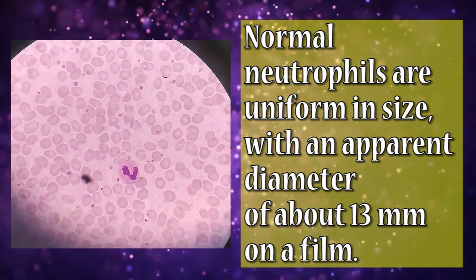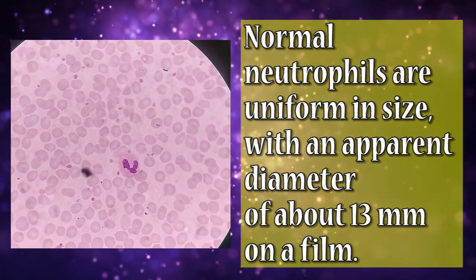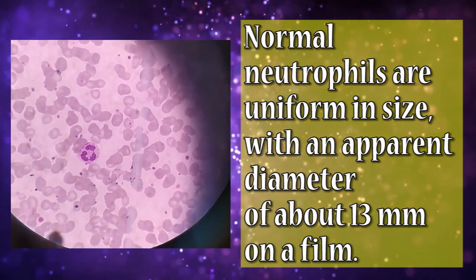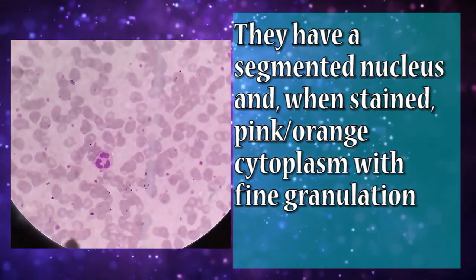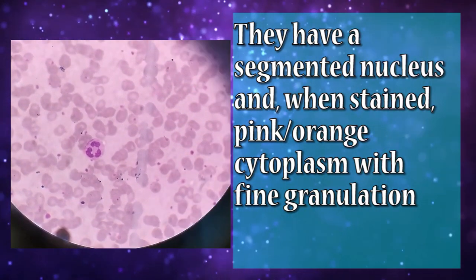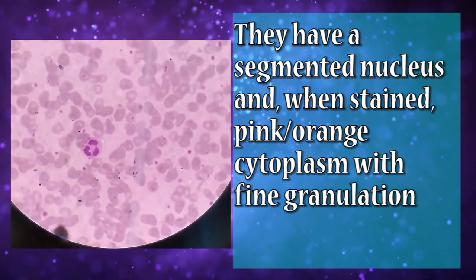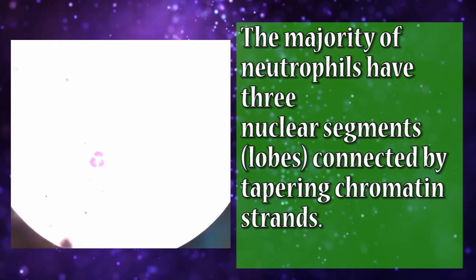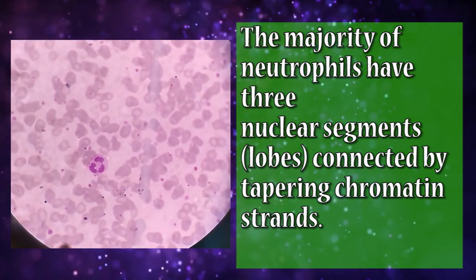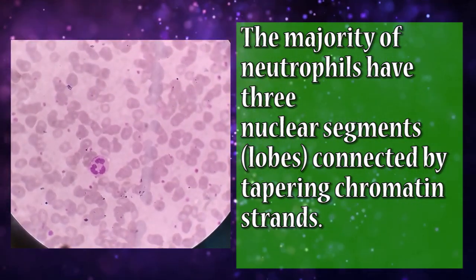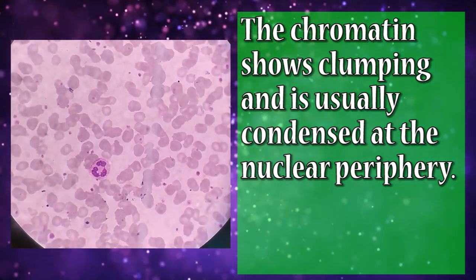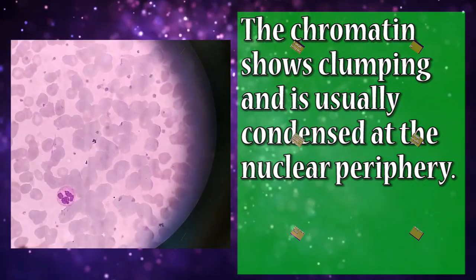Neutrophils are uniform in size with an apparent diameter of about 13 micrometres on a peripheral blood smear. They have a segmented nucleus and a pink-orange cytoplasm with fine granulation. The majority of neutrophils have three nuclear segments — i.e., loops — connected by tapering chromatin strands. The chromatin shows clumping and is usually condensed at the nuclear periphery.